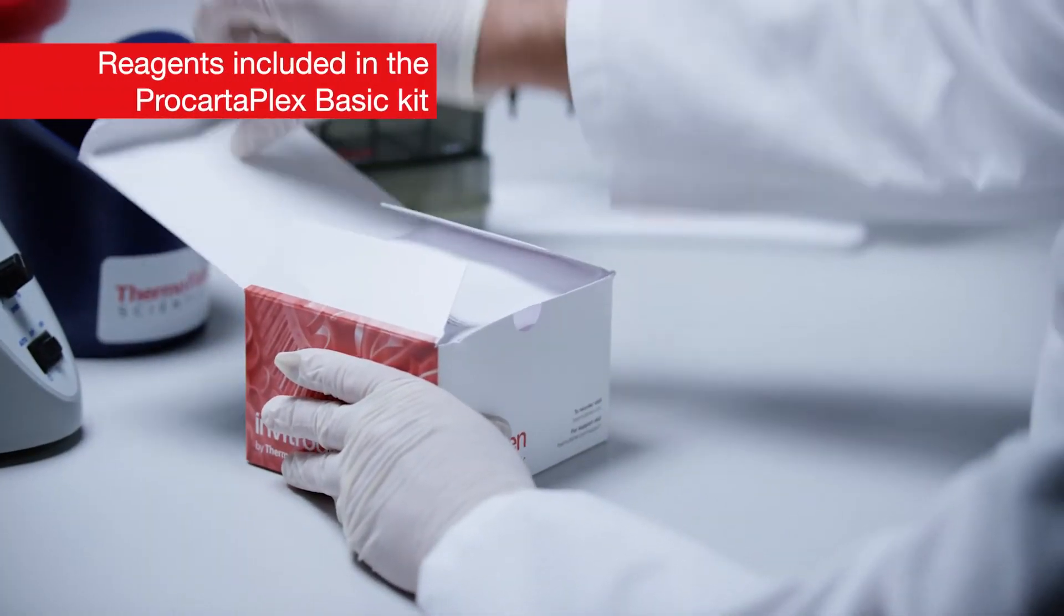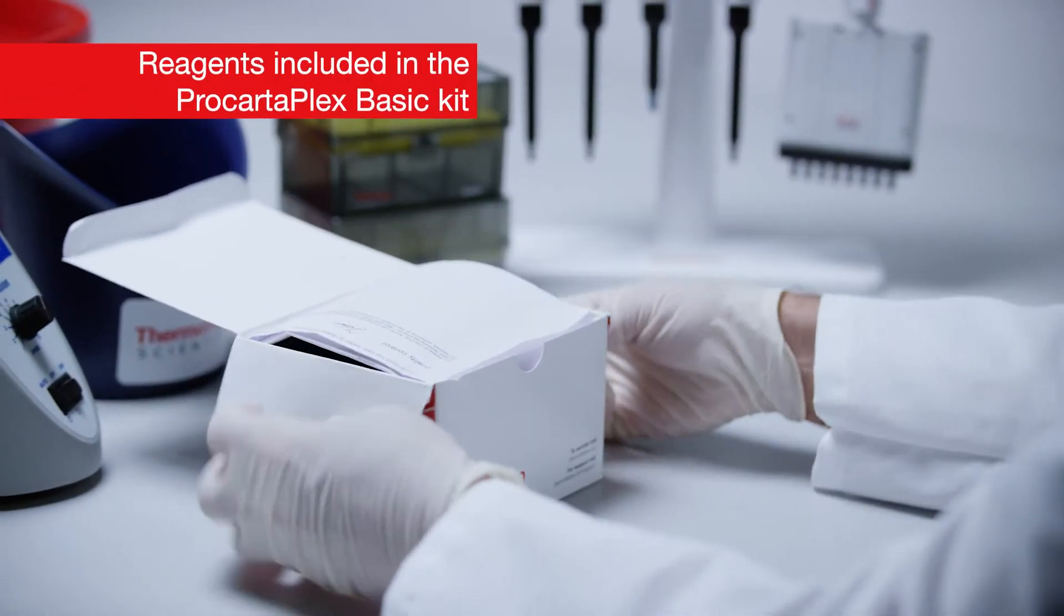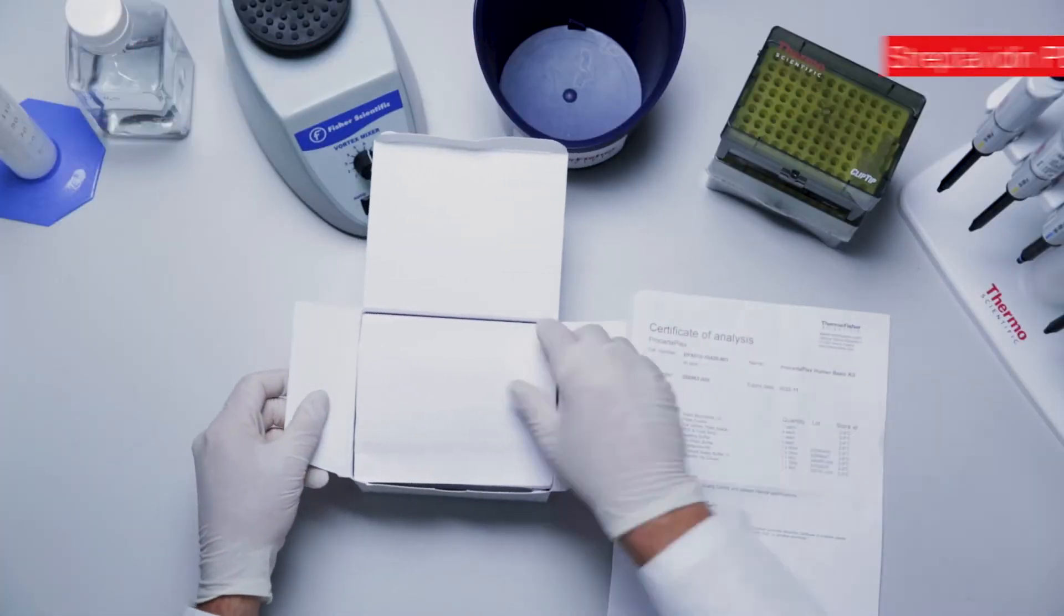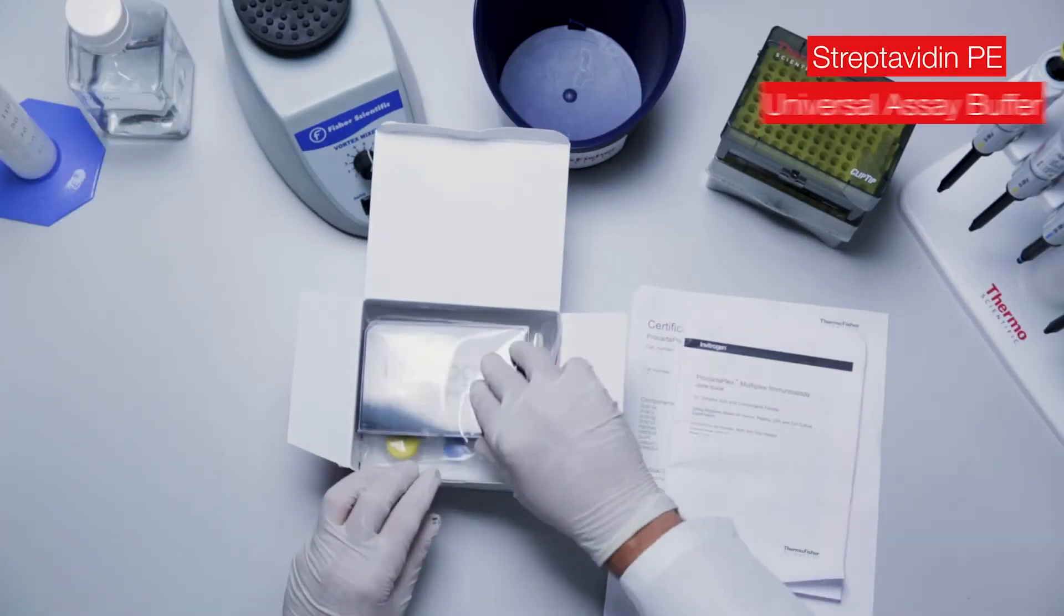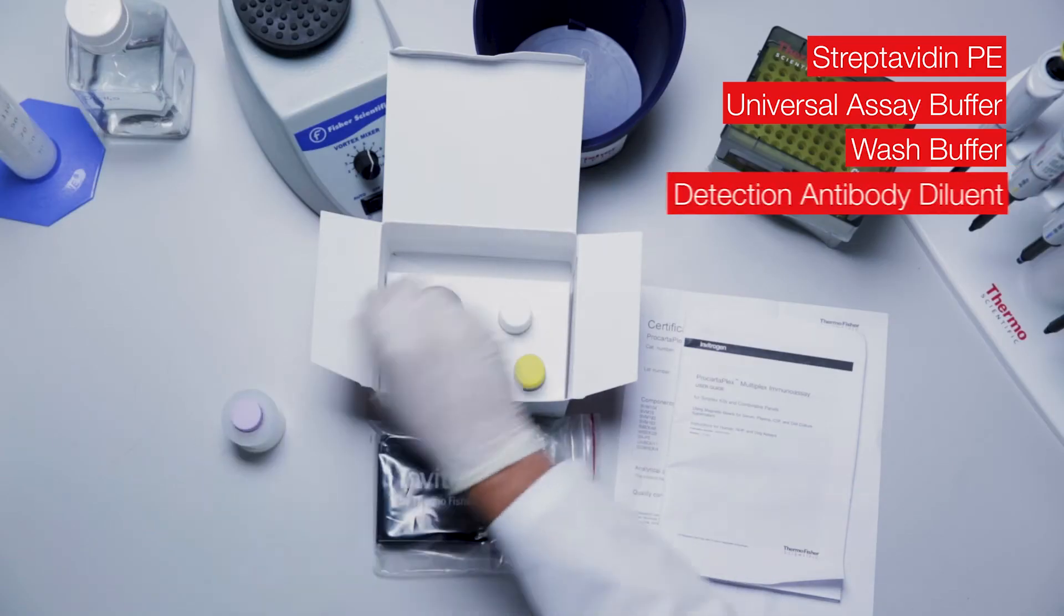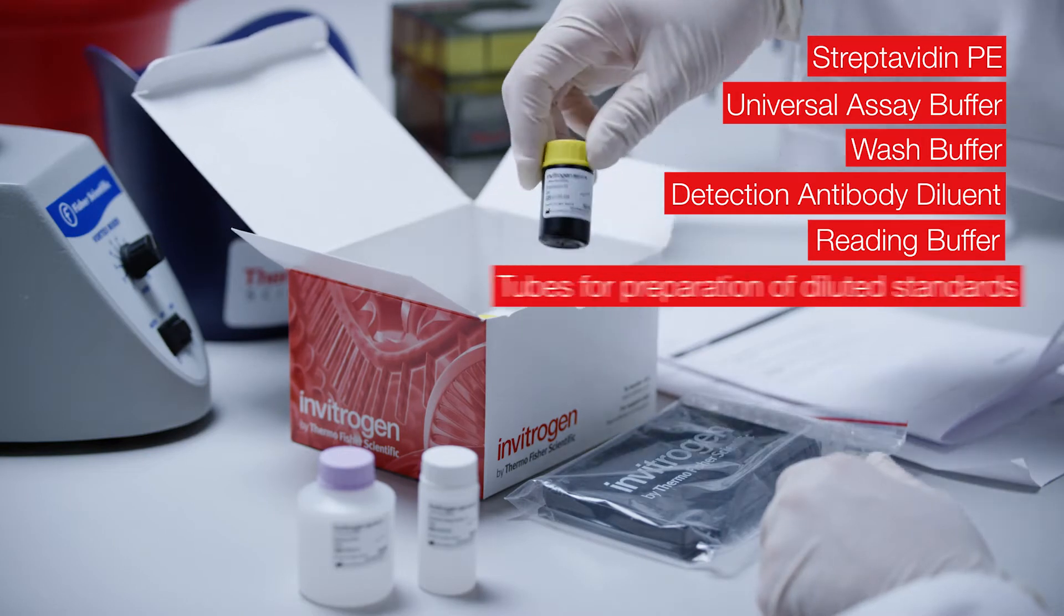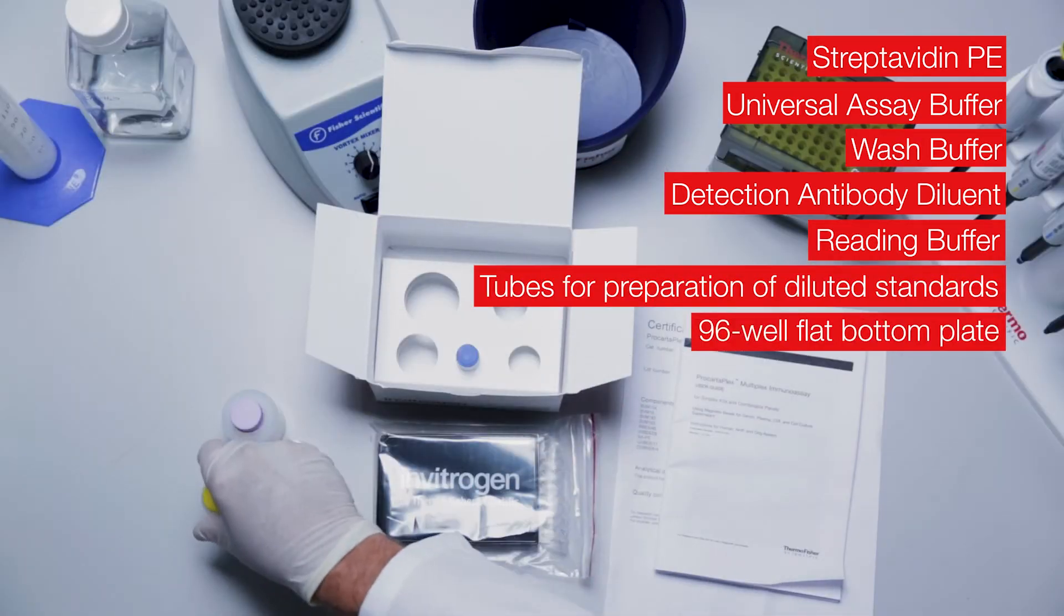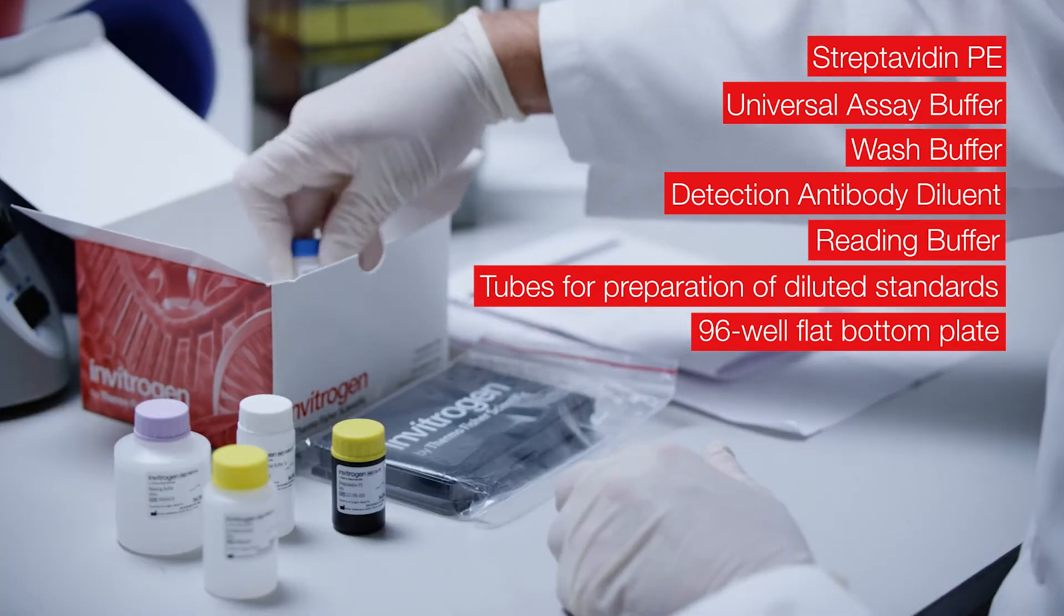Only one basic kit is required to combine the simplexes for an assay. The basic kit contains streptavidin PE, universal assay buffer, wash buffer, detection antibody diluent, reading buffer, tubes for preparation of diluted standards, a 96-well flat bottom plate, and plate seals.